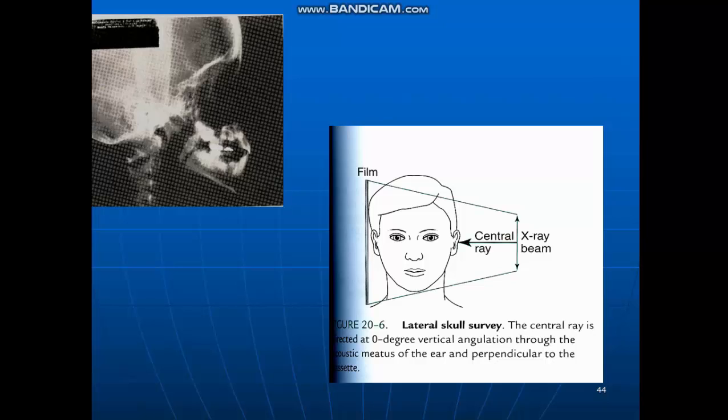This lateral skull view projection shows the skull wall and facial skeleton from the lateral aspect. The main difference between the true lateral skull and the true cephalometric lateral skull taken on the cephalostat is that the true lateral skull is not a standard method. This view is used when a single lateral view of the skull is required, but not in orthodontics or growth studies.